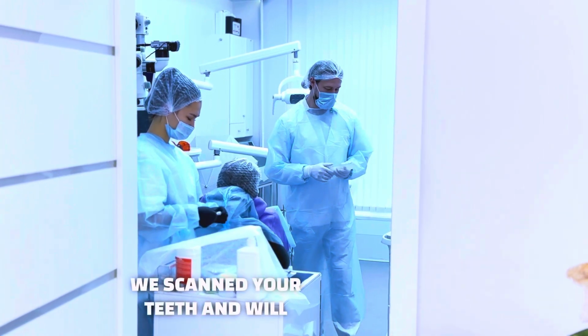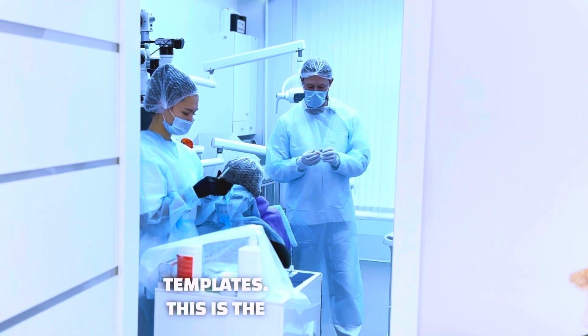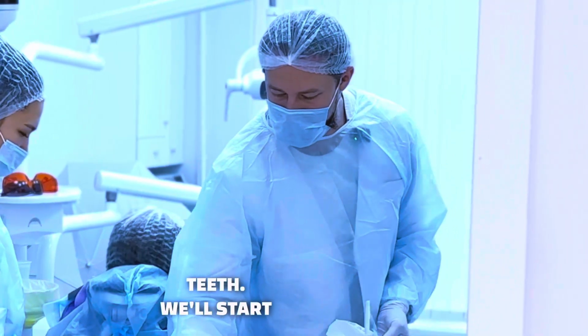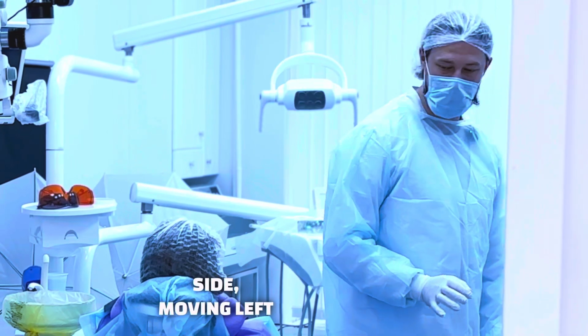We scanned your teeth and will use surgical templates. This is the surgical template. It's ready to be put on the teeth. We'll start implantation on the right side, moving left as we proceed.